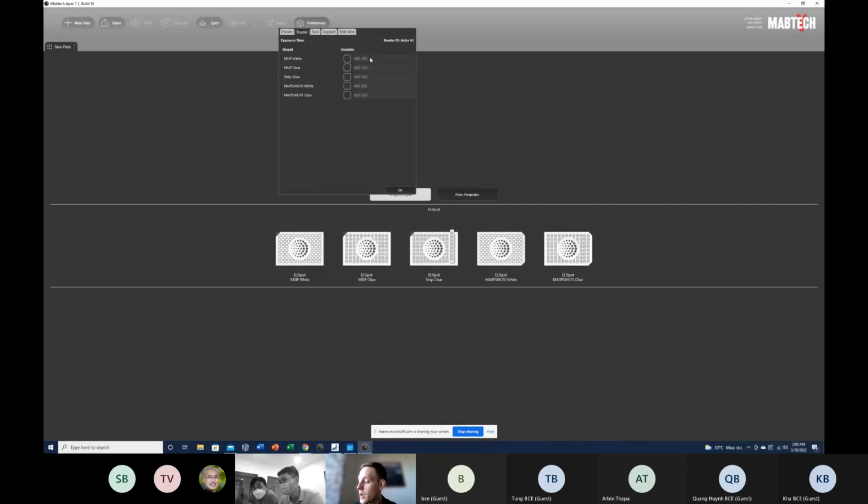Great. So what we can see here is the machine default exposure times. It's basically the different camera exposure times used when reading the different plate formats. These exposure times have been quality controlled in our in-house QC process.